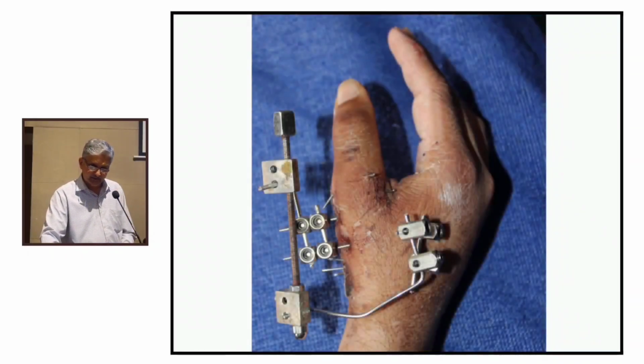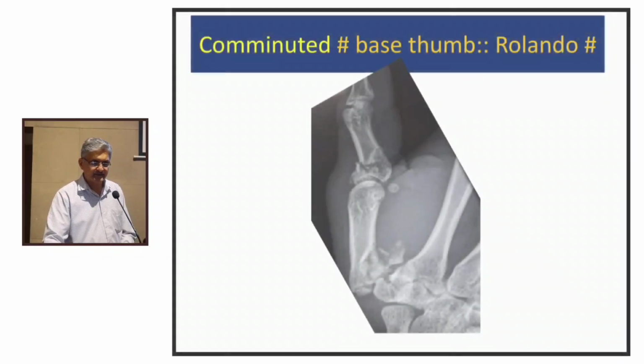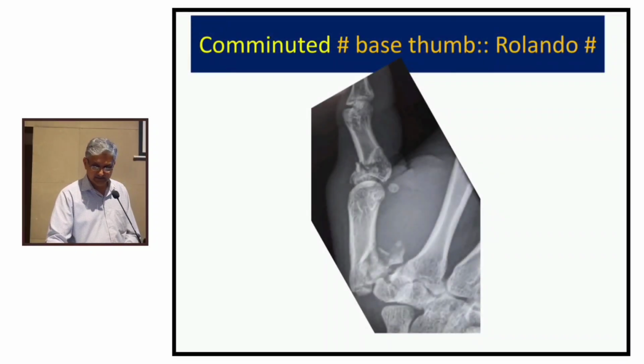Rolando fracture. So what you do, you have a good purchase on the metacarpal. This is the fracture, the first metacarpal base. Have purchase either on the radius or the second metacarpal, and now one assembly here, second assembly here, and use the distractor. Once you have this distractor, this can be brought more distally. What that basically does is, these fragments hopefully will fall in place under the effect of the pull on the capsule, and that pull on the capsule is called ligamentotaxis.